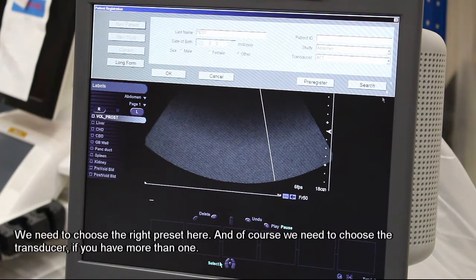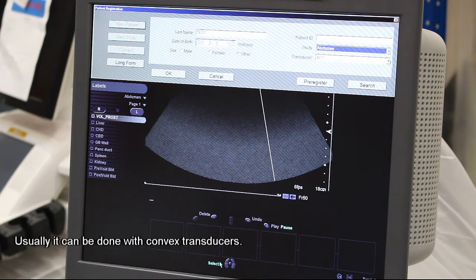We need to choose the right preset here. And of course, we need to choose a transducer if you have more than one. Usually it will be done with convex transducers.